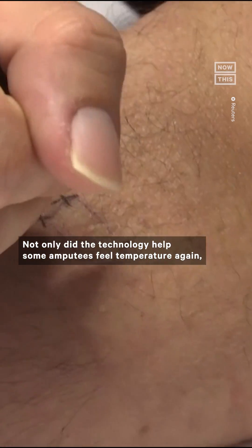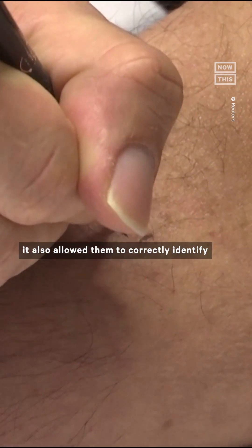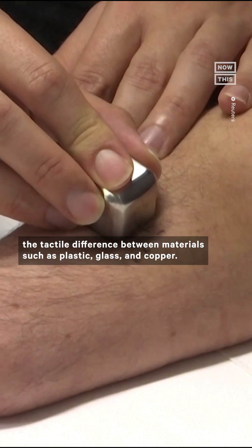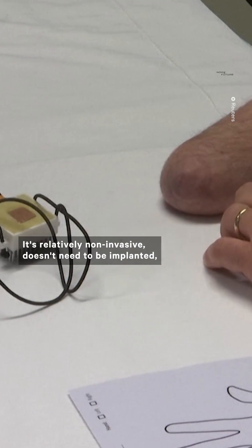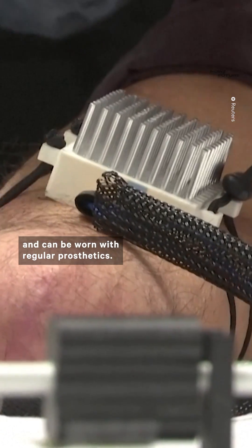Not only did the technology help some amputees feel temperature again, it also allowed them to correctly identify the tactile difference between materials such as plastic, glass, and copper. It's relatively non-invasive, doesn't need to be implanted, and can be worn with regular prosthetics.